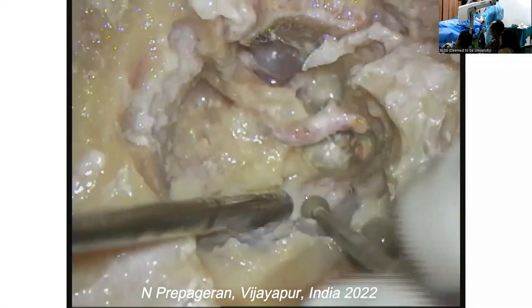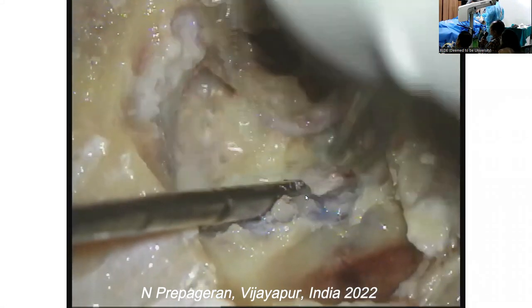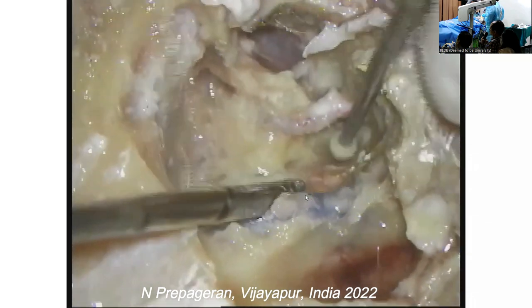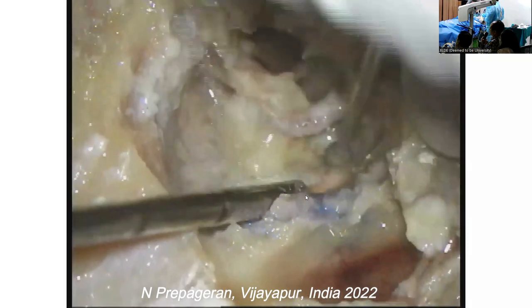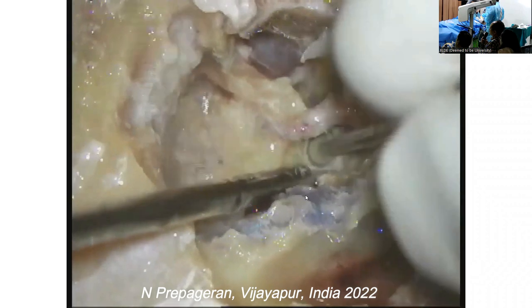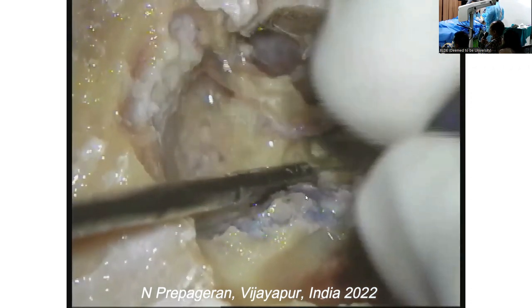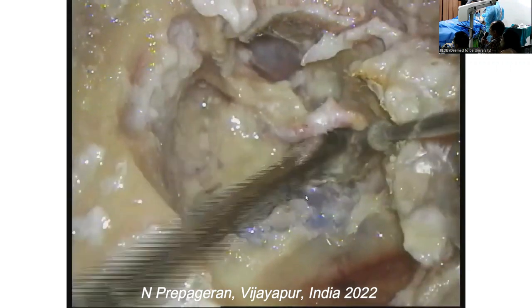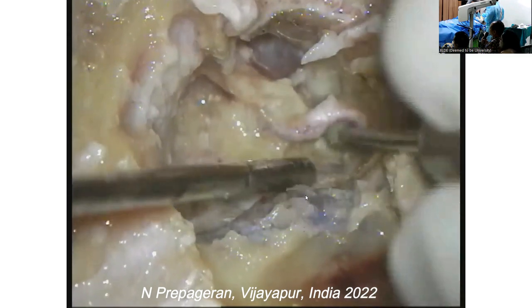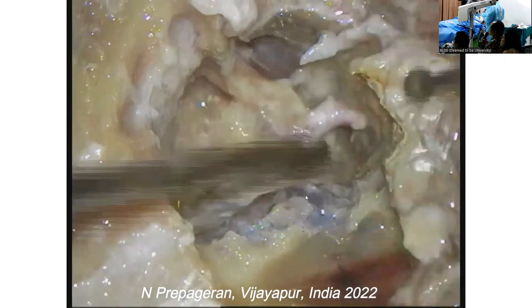Can you see? The best way to do this would be to actually cut the jugular bulb completely. Let me open up the sigmoid sinus. Then you can see the jugular bulb coming into view. His jugular bulb is not very big. It's only up to here. Usually the dominant jugular bulb will come up to here. His jugular bulb is small. So you've already exposed the jugular bulb, as you can see.